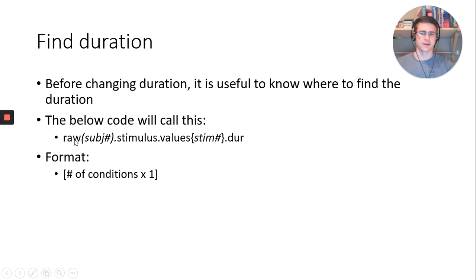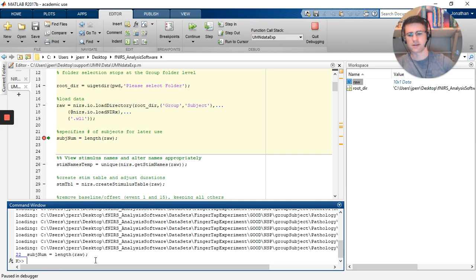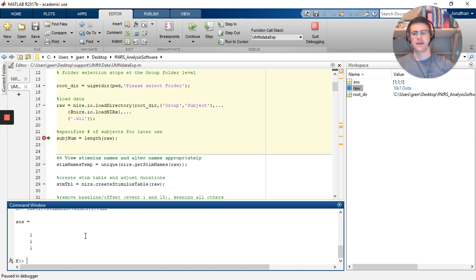Or you can call it in the command line. Here I have my raw variable, which is what I saved my data as. I'm going to select a subject number, do .stimulus, .values, curly brackets, and select which stimulus I want. We have two stimuli in this condition. This was a left and right finger tapping test. So raw, select my subject, subject 1, .stimulus, .values, curly brackets, trigger number 1, .dur. When I hit that, I get a return of one column with three rows. This tells me I have three occurrences of that stimulus, each with a duration of one second.